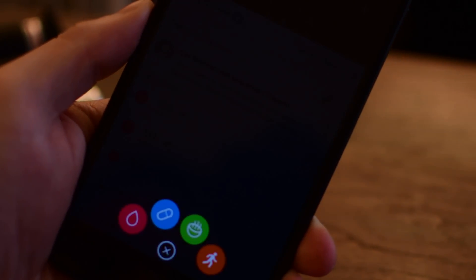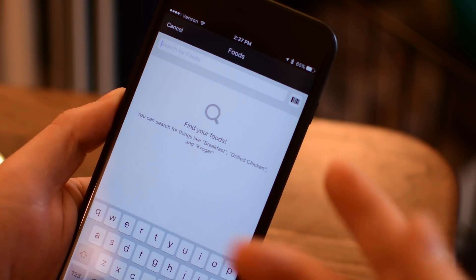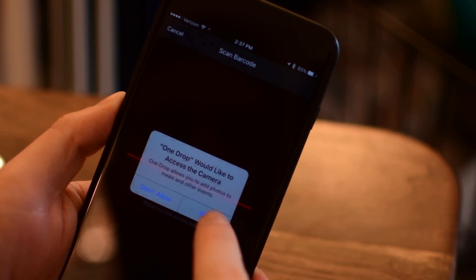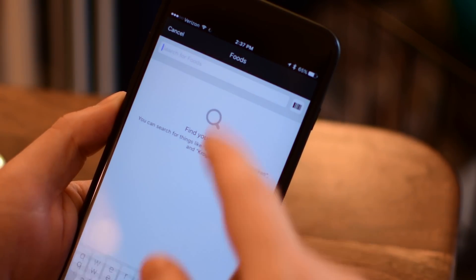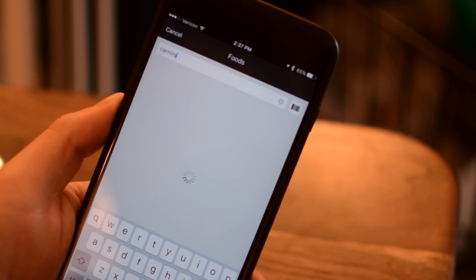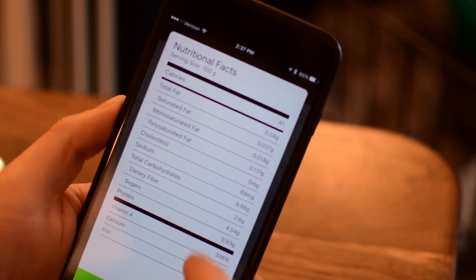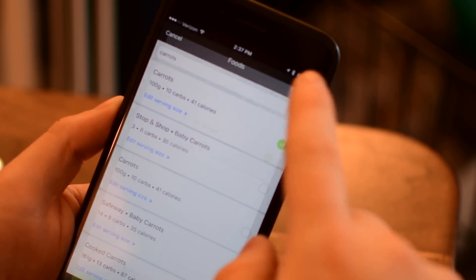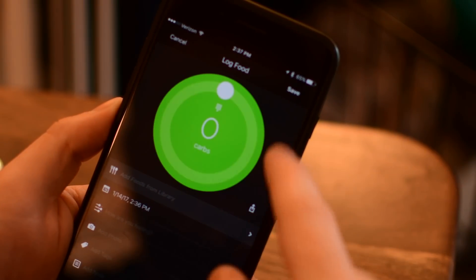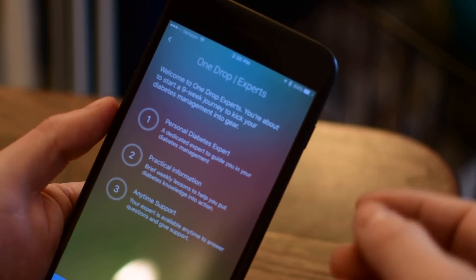You can see how medications may affect your blood sugar. You can add exercise, which will also pull in from HealthKit on your iPhone or iOS device. And then you can even add food — it has a full food database that you can go through, look up your food, or use the barcode scanner and scan a package of food that you may have. It's a very robust food option. You can actually create meals, so you can add certain types of ingredients and create an actual meal that you add to your log. You're really getting a full comprehensive picture of your diabetes lifestyle.